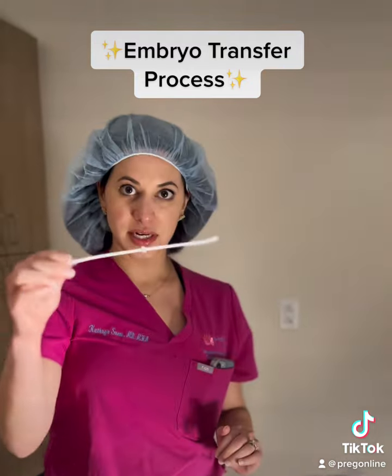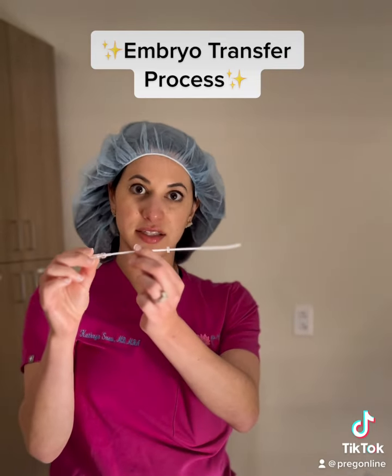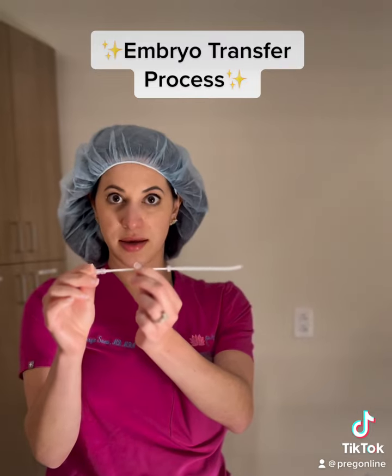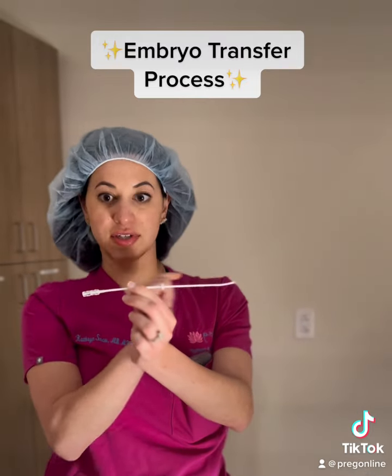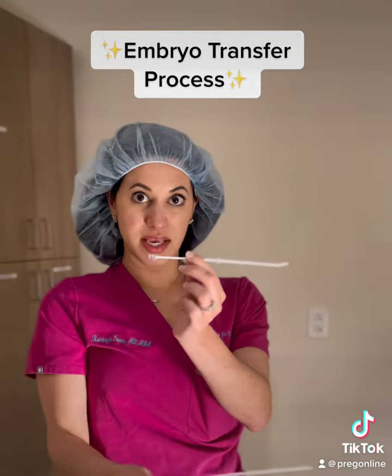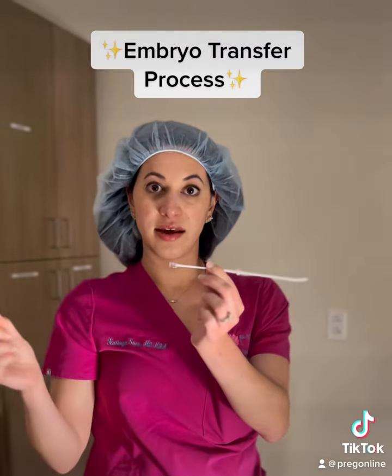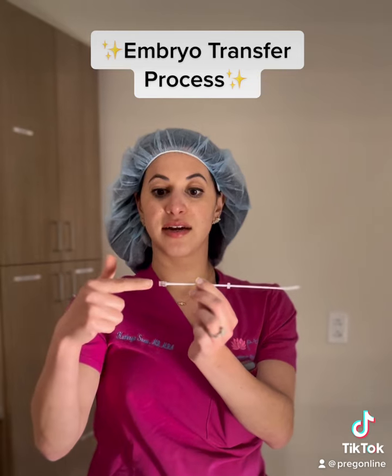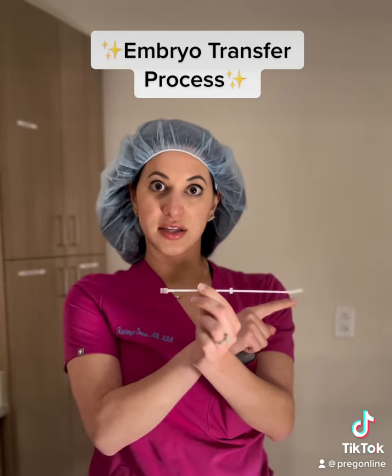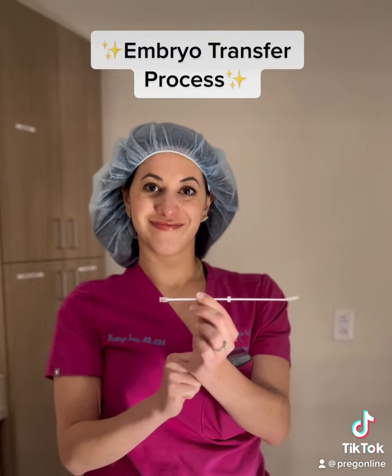Lastly, we use an embryo catheter that looks like this, and what's neat about this catheter is it's sort of a placeholder. So once we get this catheter into the correct spot, which we're able to see using the ultrasound, we can take the inside of the catheter out, and McKenna, or whoever is in the lab that day, would bring in the embryo and fish that embryo through this outer sheath of the catheter. We then look at this on the ultrasound and confirm we're in the right spot of the uterus. And that's it.